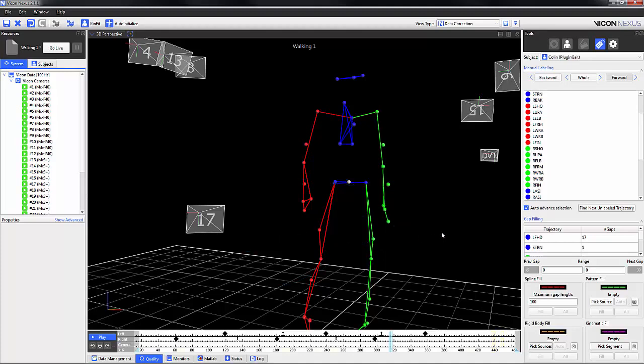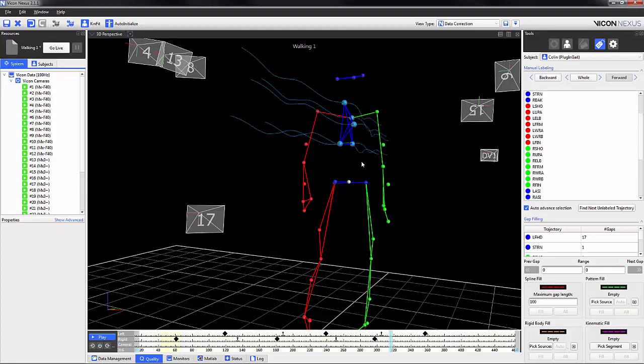Alternatively, you can hold down the ALT key and draw a box around a few markers. This will select the markers within that box. Pressing CTRL and the space bar will show the labels of only those markers selected.